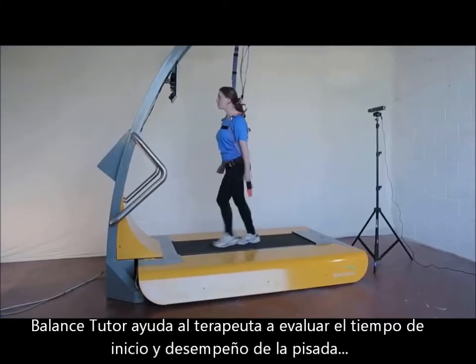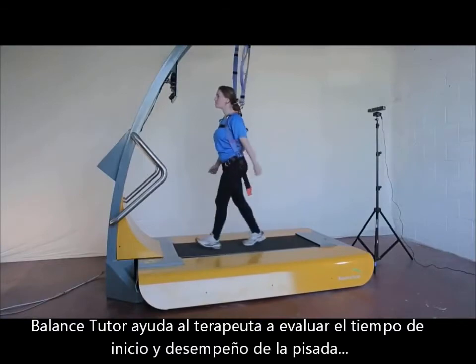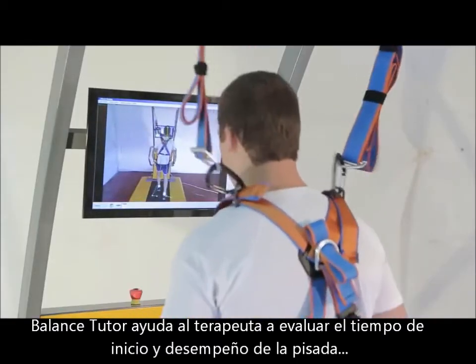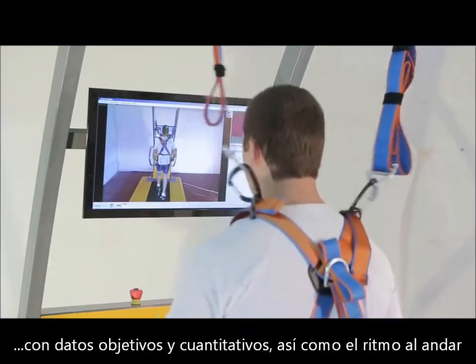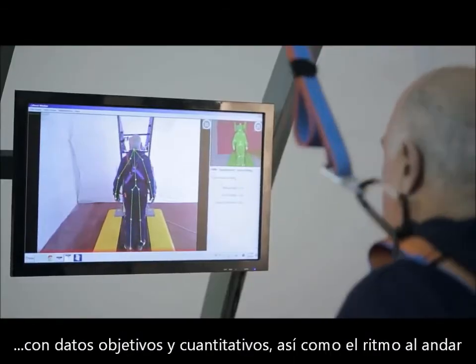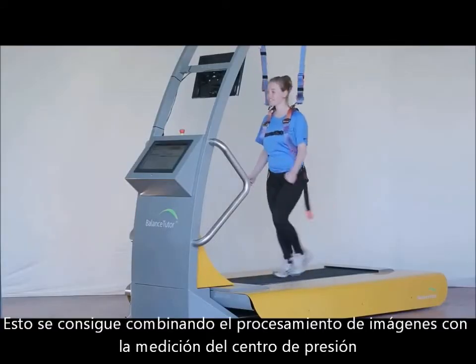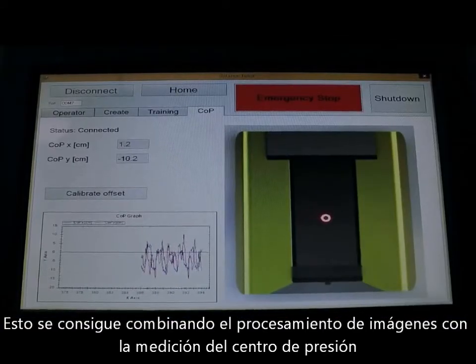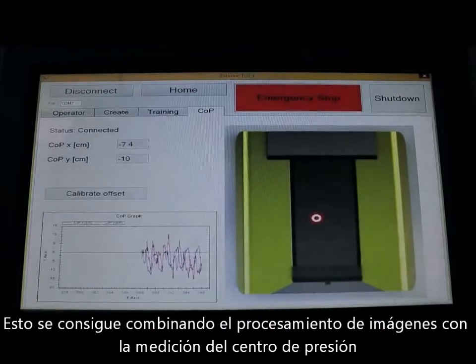The Balance Tutor allows the therapist to objectively and quantitatively evaluate compensatory step initiation time and performance, as well as gait. This is achieved by combining image processing and center of pressure measurements.